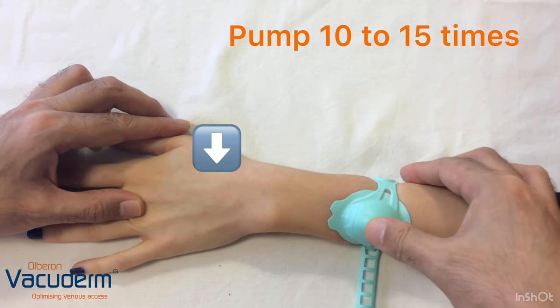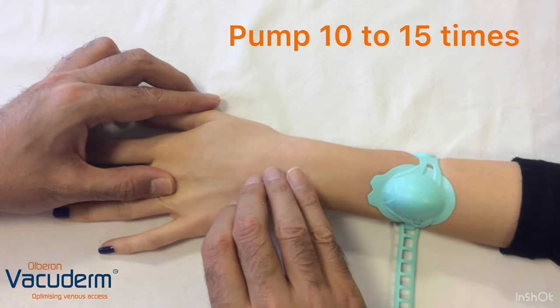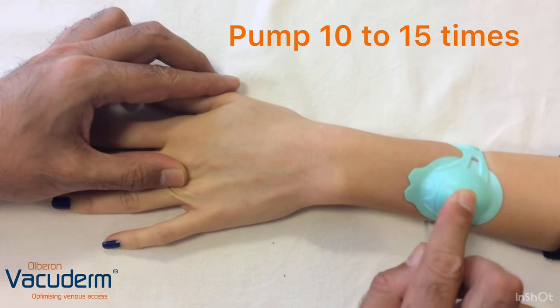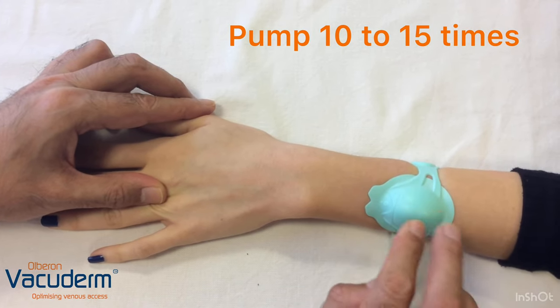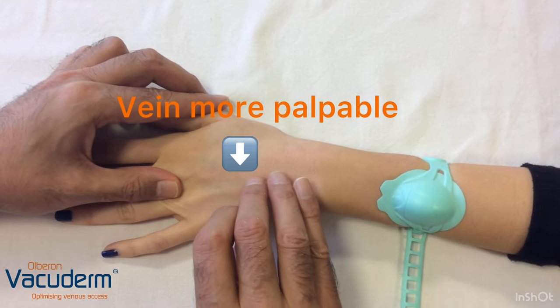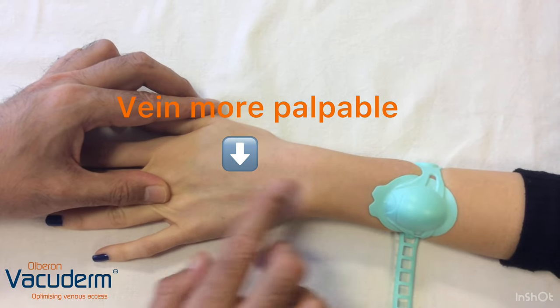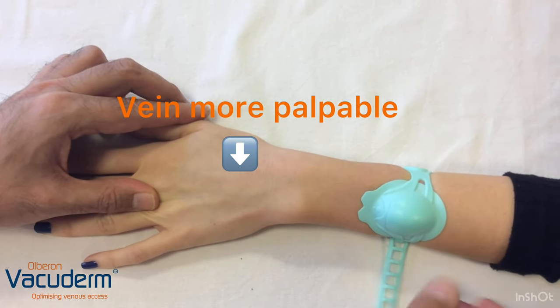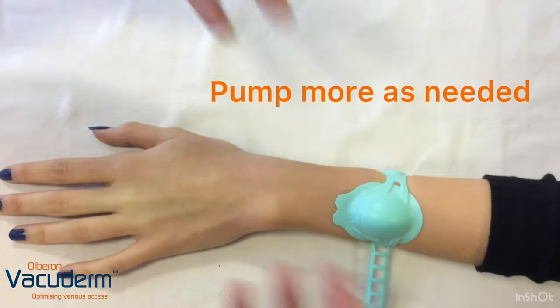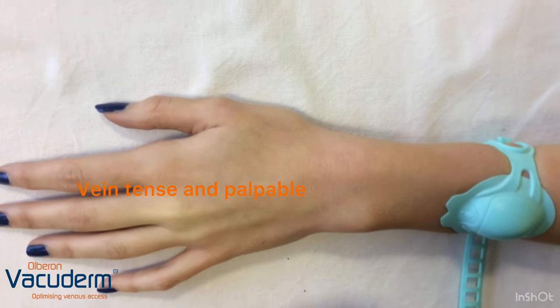If we pump for about 10 to 15 times over 60 seconds, we can see this vein — which is a small vein to begin with, but if that's all you had — becoming increasingly bigger and tenser and more palpable. If that's all you had, you could work with that for cannulation with further pumping a few more times. This could potentially optimize the vein for cannulation if it was the only vein available.